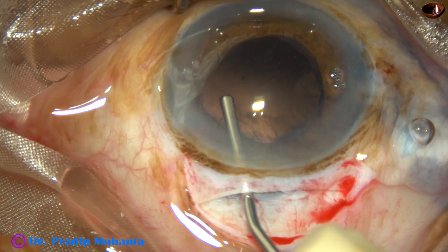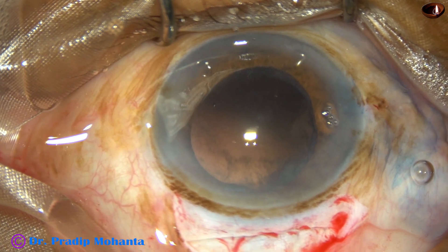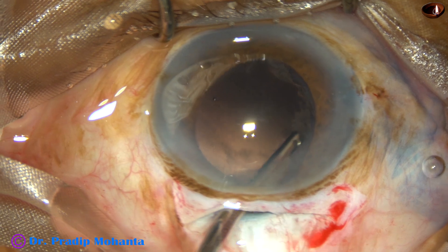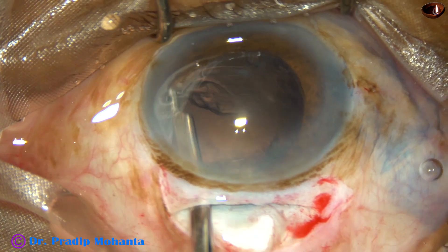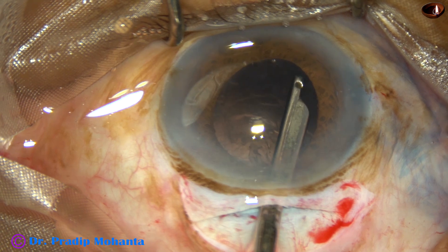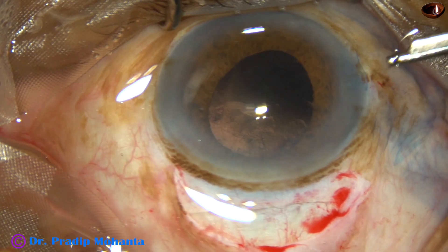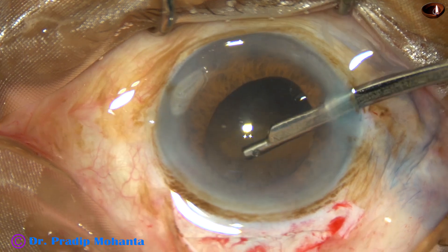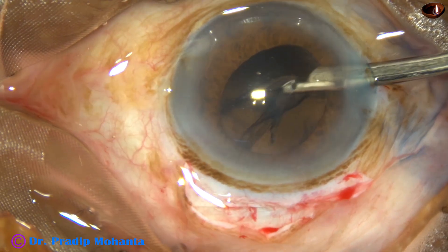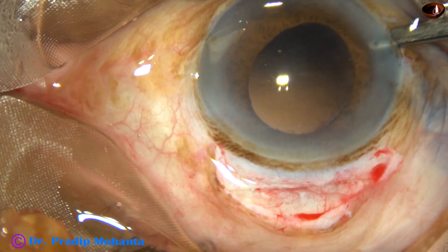Now visco is used to fill the anterior chamber and the capsular bag, and I am going to remove the cortex. If you fill the AC with visco, you can use the main wound for some time — until all the visco comes out — and remove a lot of cortex. Remove the cortex from the sub-side port area first, then go through the side port. Even without visco in the anterior chamber, since you have gone through the side port, the anterior chamber is nicely formed.